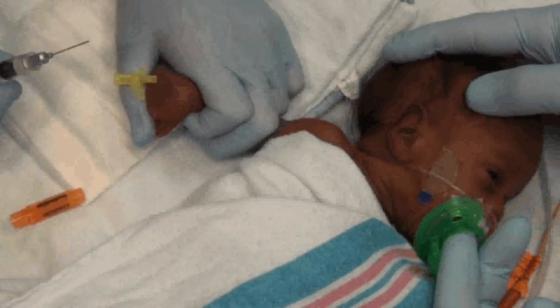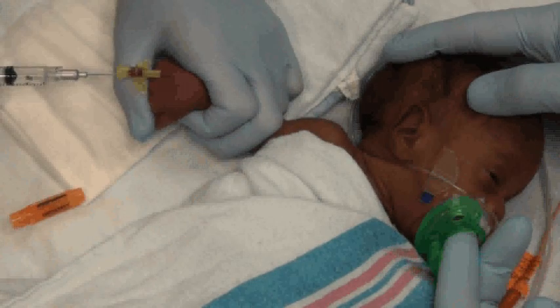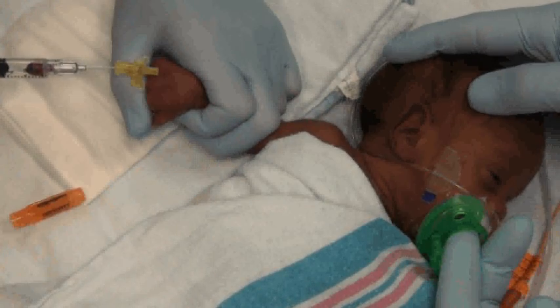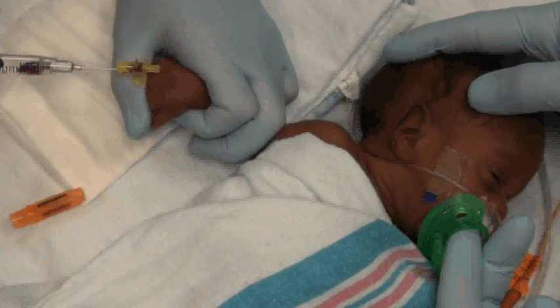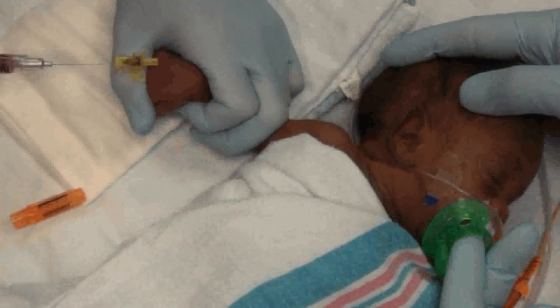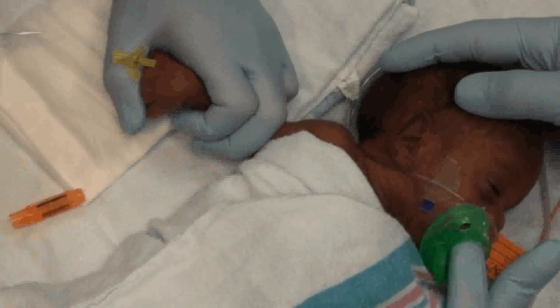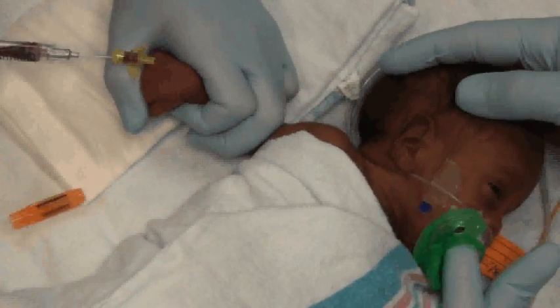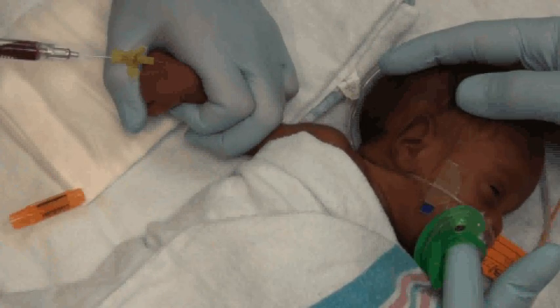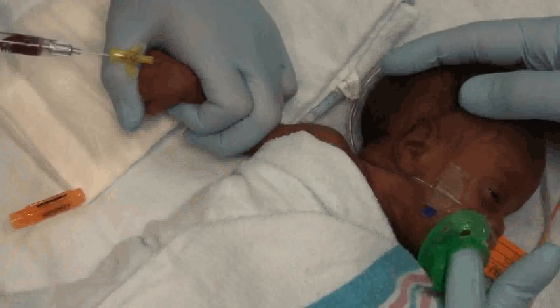A 3ml syringe with a blunt tip is then utilized to aspirate the free-flowing specimen. 1.5 milliliters of blood is required for this particular blood drawing opportunity.